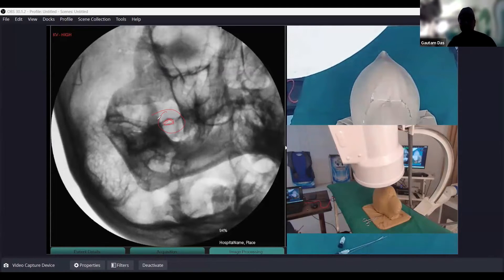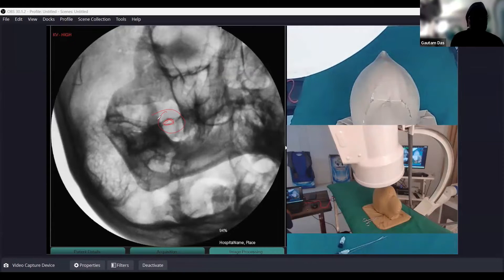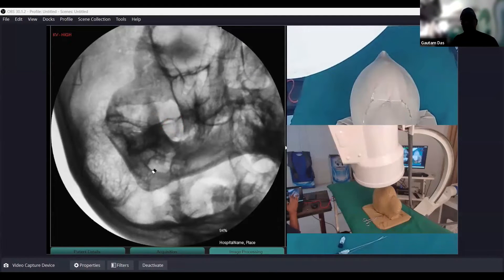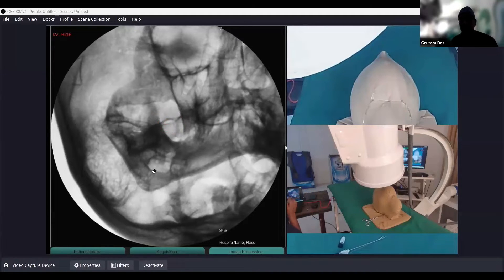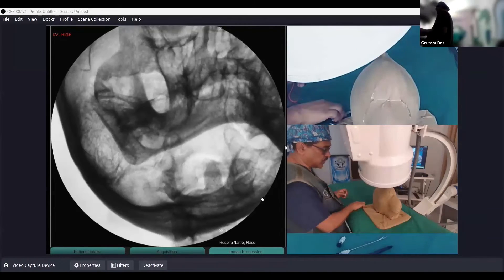Whenever you are not able to find the foramen ovale, always start from the beginning: start from the AP, make a caudal tilt until you see the inverted V of the mandible — which is known as the submental view — and then make an ipsilateral oblique until you find the foramen ovale.